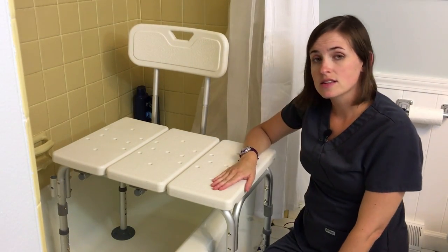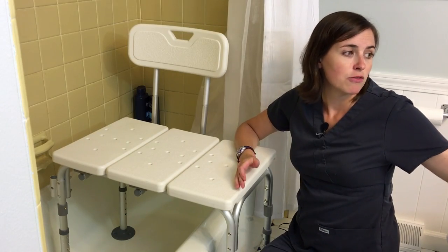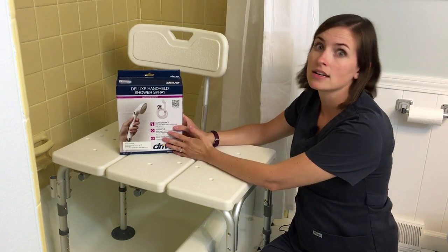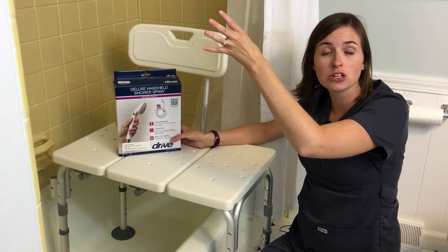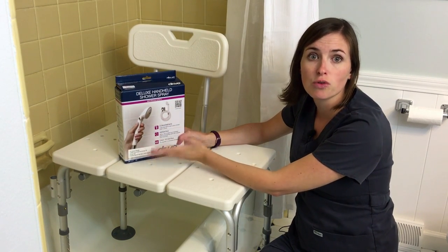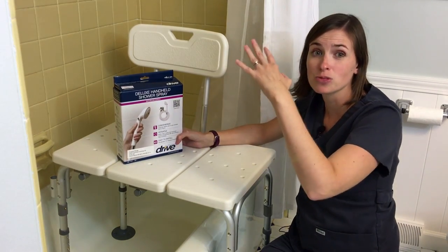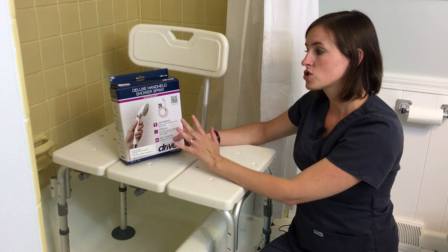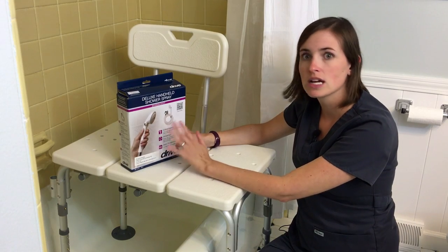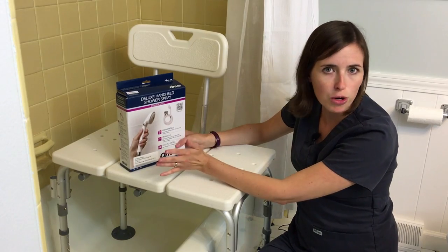Another thing to consider when installing a tub transfer bench is some accessories that I highly recommend. First, I very much recommend a handheld shower head anytime somebody is going to be doing a seated shower. Just remove the existing shower head and replace it with one that has a long hose — that can make all the difference in the world for comfort and independence, because having the shower sprayed directly in your face is really abrupt. These are quite simple to install, come in many styles, and no plumber is necessary.